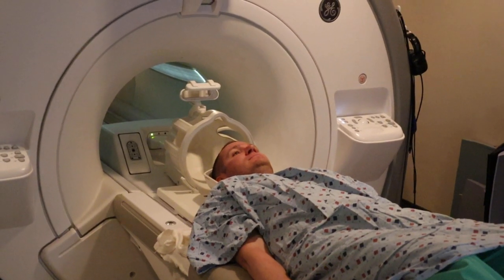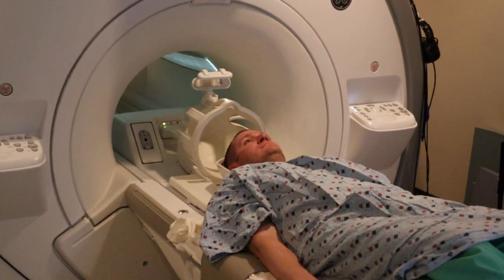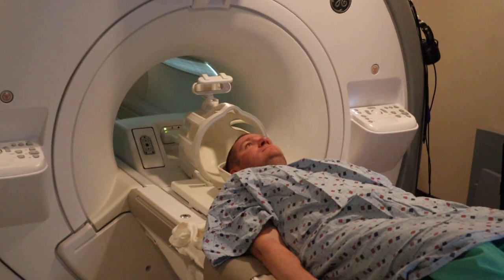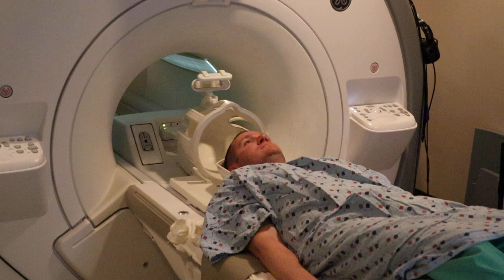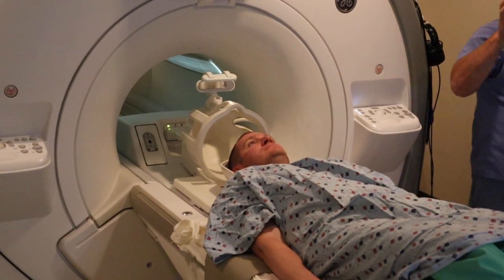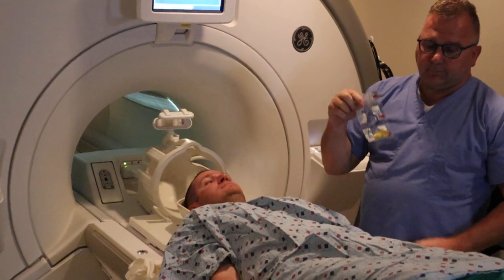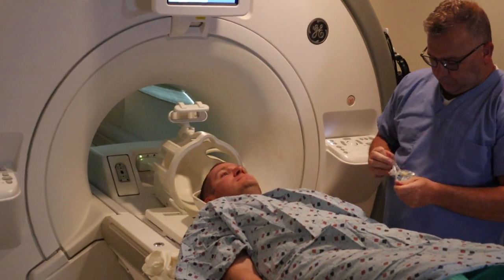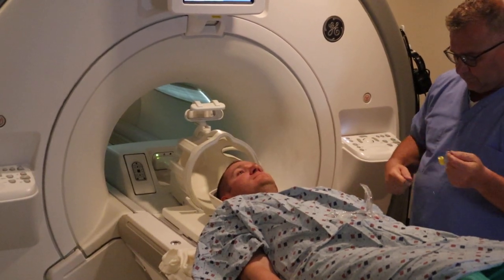The landmark for the brain study, including all the other categories, is the nasion. You want to make sure the head is straight in anatomical position. Ear plugs are placed for the patient for the noise, and you want to make sure the patient's head is not tilted to the left or to the right.